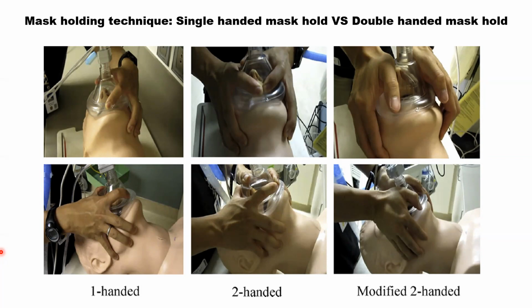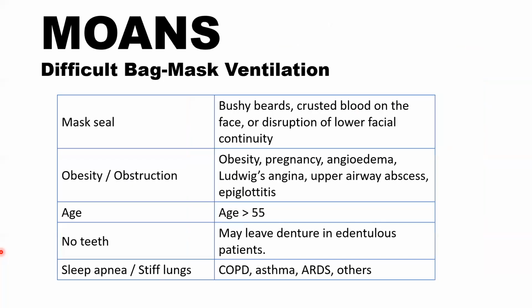So sekarang ni dekat HSP, you all kenal sebab you ada feedback. Kalau you kena campak ke mana, ataupun if you want to be a specialist, you need to master how to intubate without CMAC. CMAC ni senang je, buka kan, nampak je. Faham tak? Okay, jom, moving on.